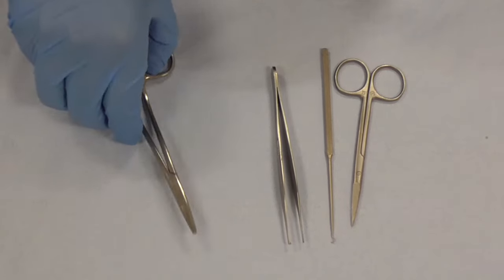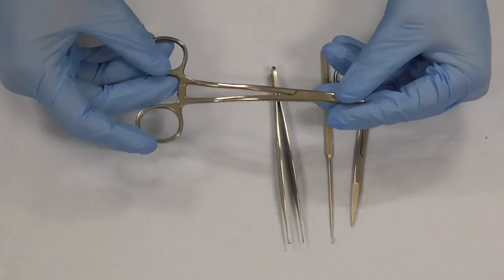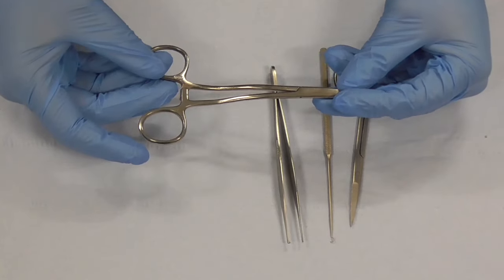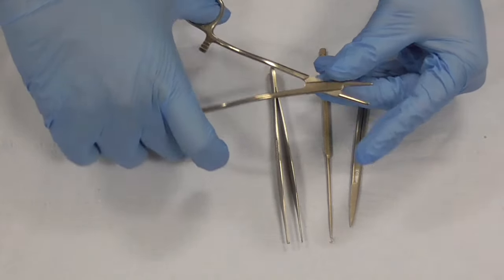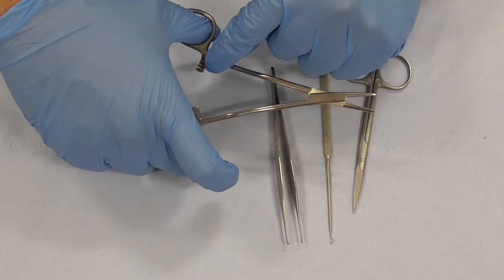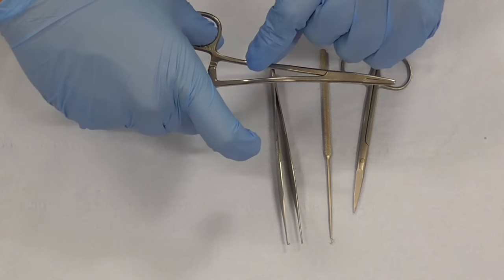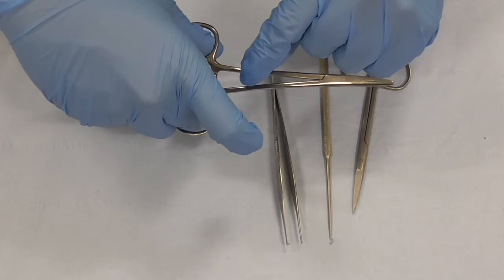The first of course is a needle holder. Now this needle holder is a ratcheted needle holder meaning there's a ratchet mechanism just there and you can see when you close it, it clicks in.